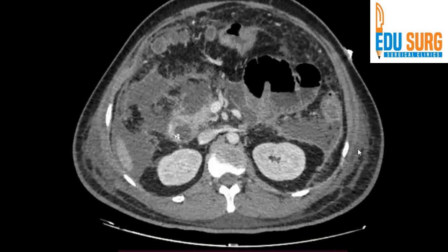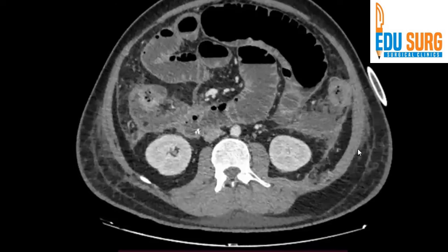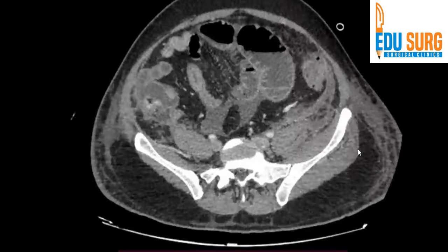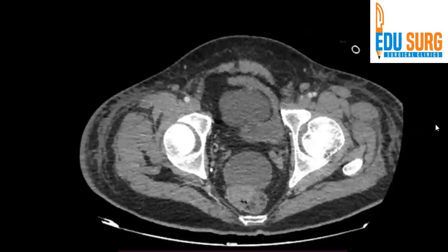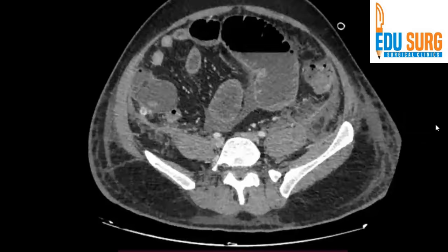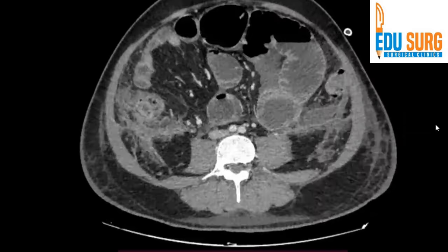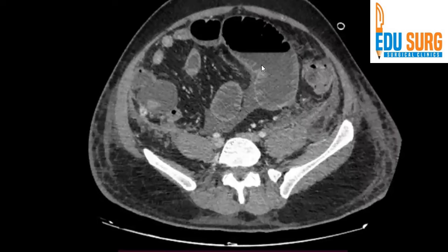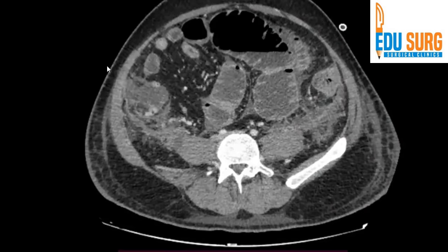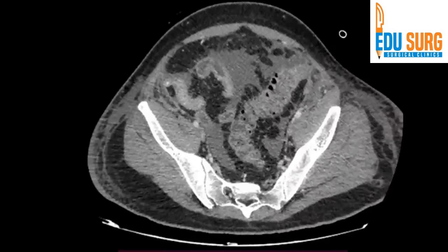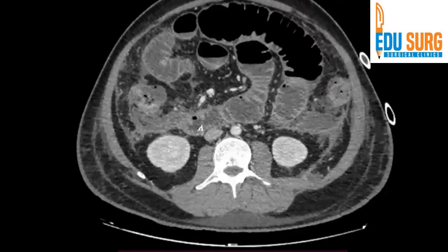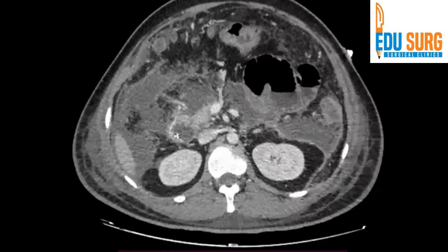Severe acute pancreatitis, lot of ascites, lot of effusion, right lower lobe consolidation, fat stranding — it's a bad case of pancreatitis. You can also see the bowel loops are very distended. To confirm dilated bowel loops, you can see more than five centimeters. Definitely dilated bowel loops — we are looking at small bowel ileus as well, and this is very commonly seen in cases of pancreatitis.